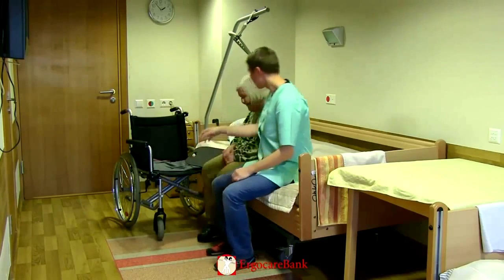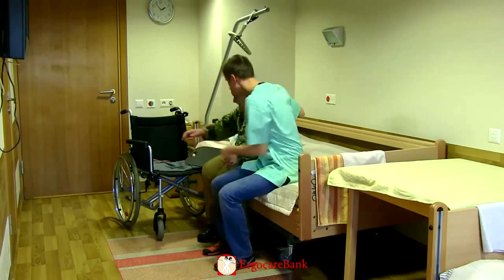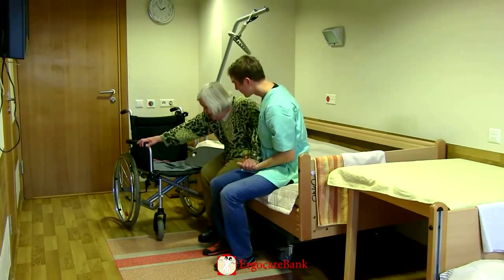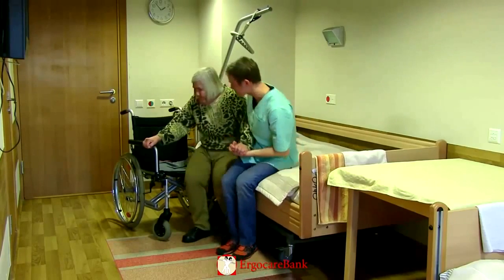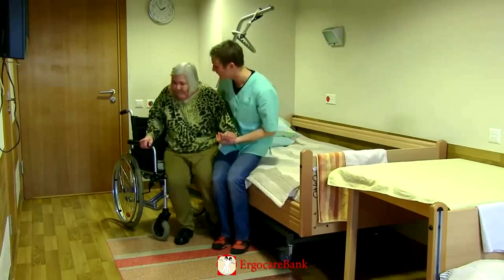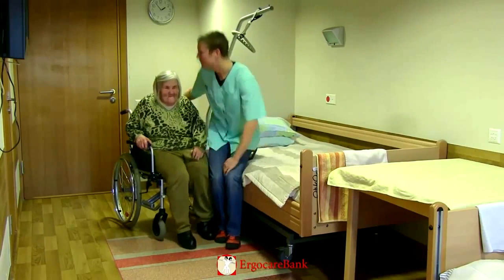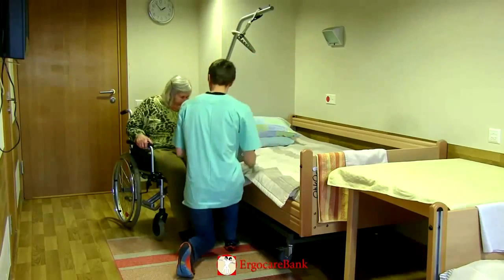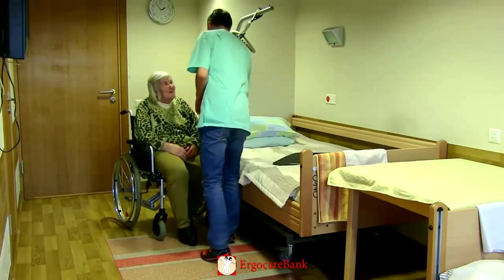He then sits down closely to Christina and holds her closest hand while she grabs hold of the far armrest of the chair. While having his arm around Christina's upper back, they lean forwards and move sideways together. When Christina is sitting well back in the chair, he removes the slide board and puts the armrests back on.